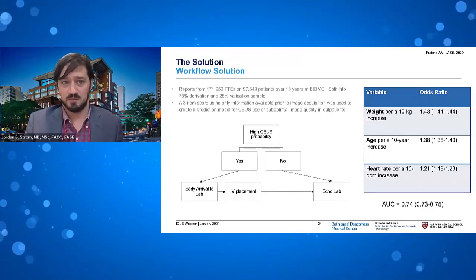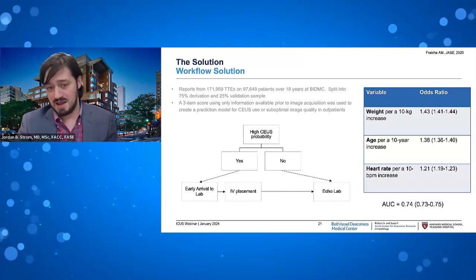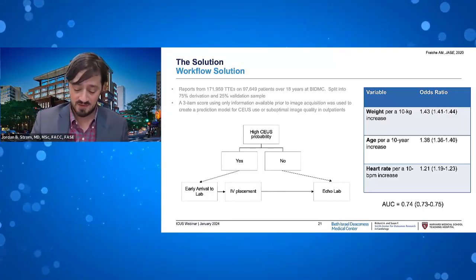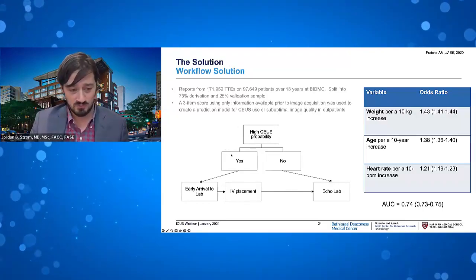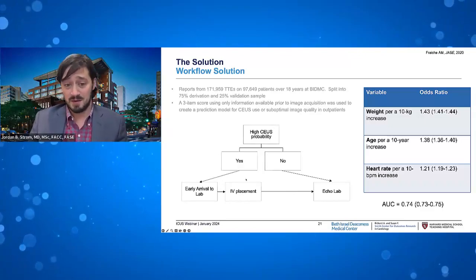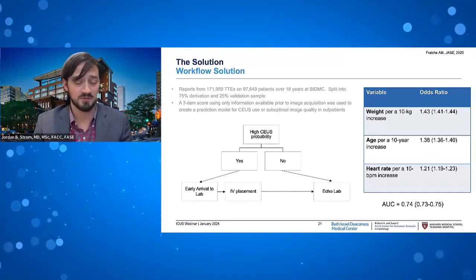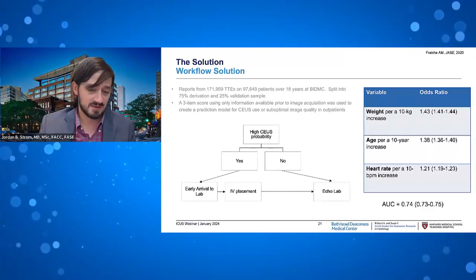And so, for example, you could have a medical assistant compute this score for everybody who's coming in for the week, and have this done. And then you could tell the people who are at high probability of needing contrast to arrive early in the lab so that they have a chance to get an IV placed before their image acquisition started. And that way, you're making the decision to give contrast based on the images themselves, not based on a workflow barrier or presence or absence of an IV in that setting.